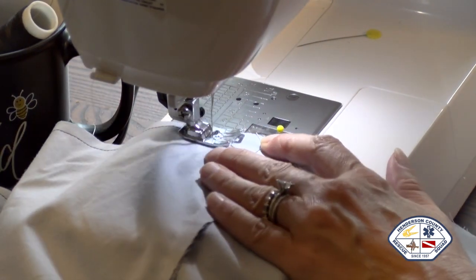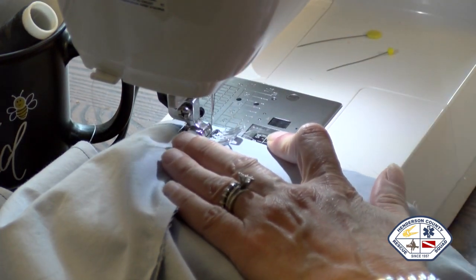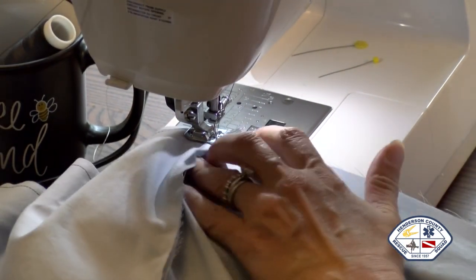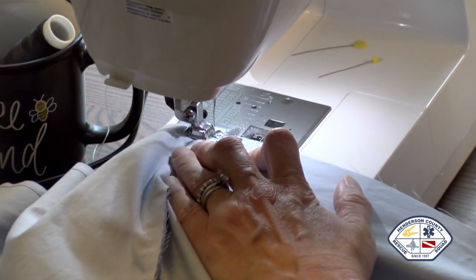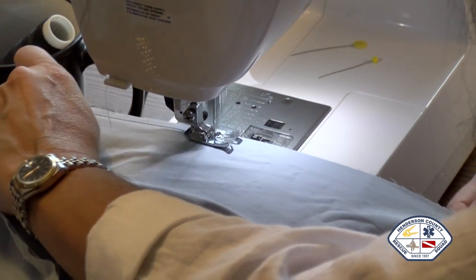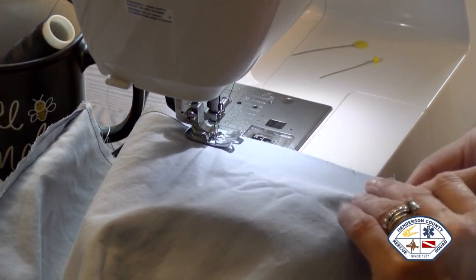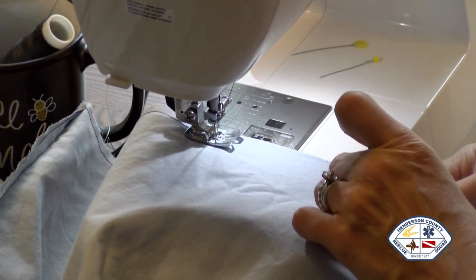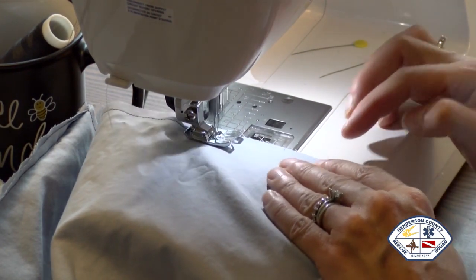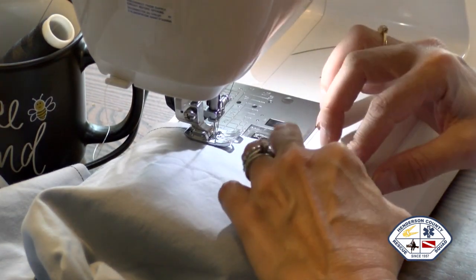Okay, now we're at the shoulder, not the neck. We don't really need to knot it here, but if we knot it, it's just a good place to give it a little more reinforcement. I'm going to keep on going up. This is a really super duper wide shoulder seam, and it's super duper wide because you're going to have personnel putting this on over their clothes. It could be turnout gear, it could be scrubs, you just never know.